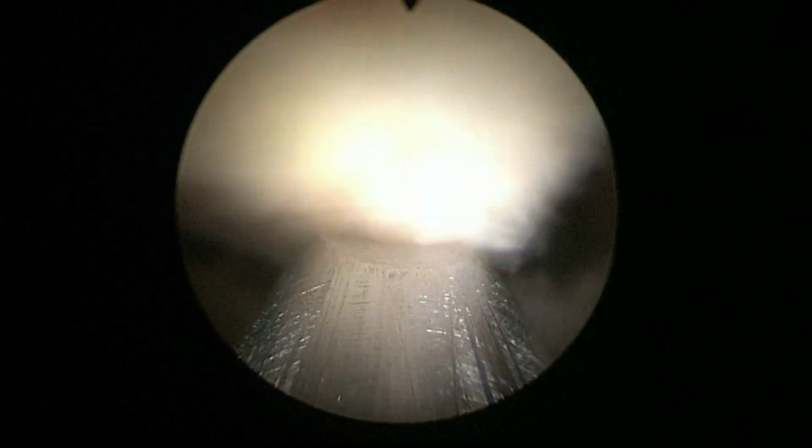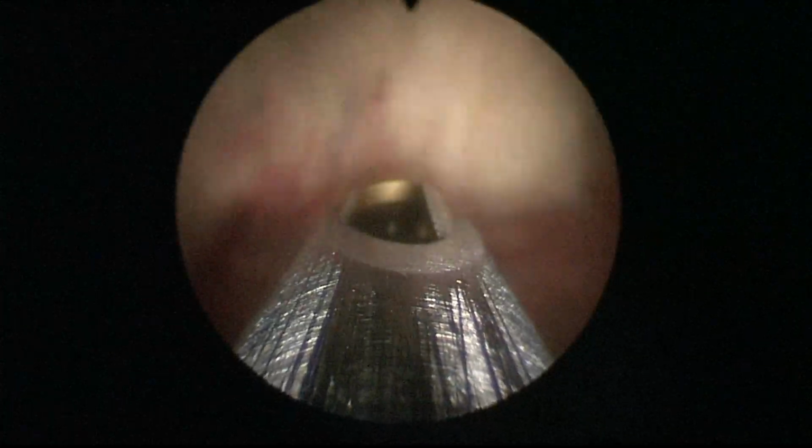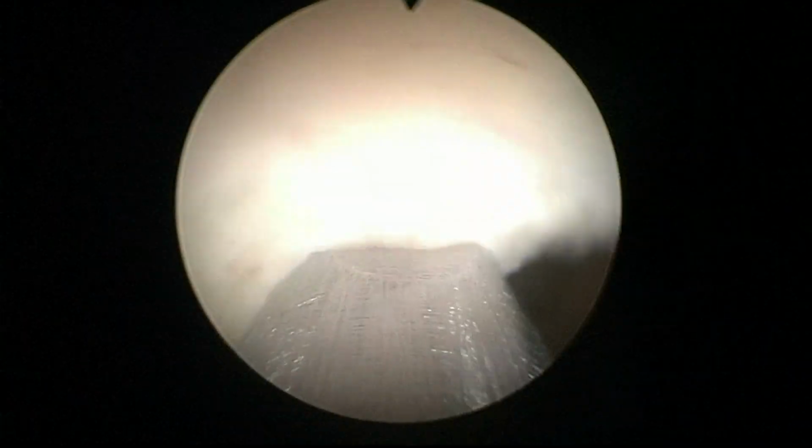You know, typically the morsellator chews the soft parts first, and if there is a very, very hard nodule, it will leave it for the end. But I think in this case, it was all okay. If the morsellation is inefficient, you have to be careful because the bladder will collapse because you will be sucking too much water. So you need to pause a little bit, let the bladder fill again before continuing. But no, this morsellation was surprisingly good.